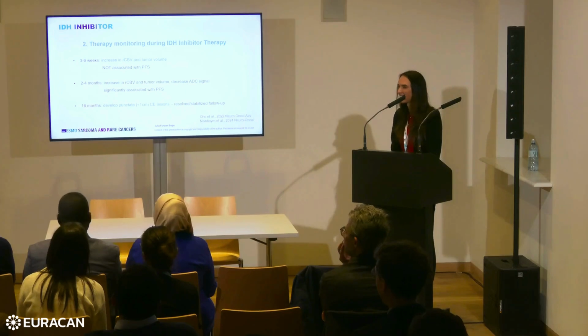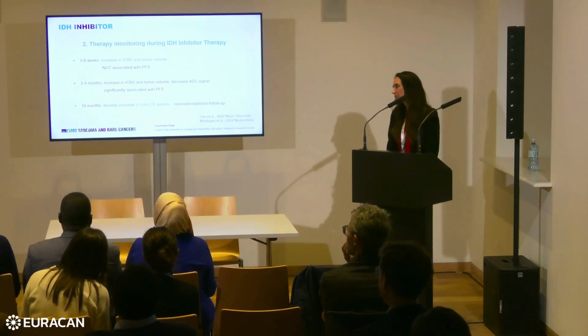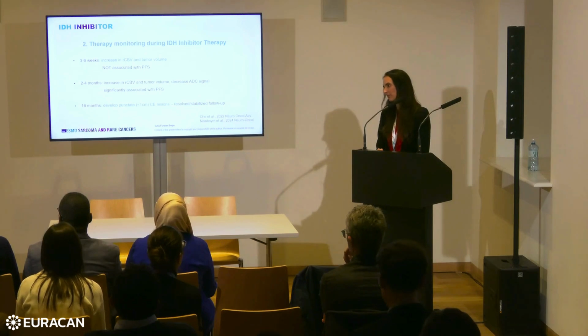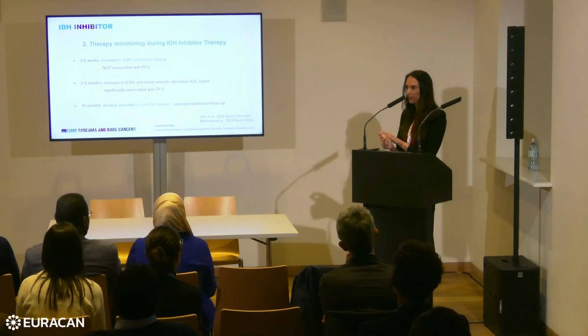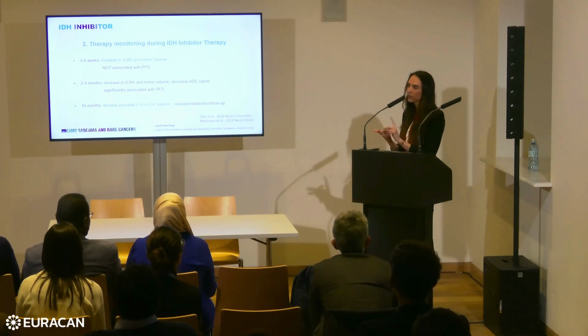And the other point, does artificial intelligence enter the field of neuroradiology as it did in other fields of radiology? Yes. Especially in detecting lesions such as brain metastasis, in differentiating different lesions, so finding the right diagnosis.